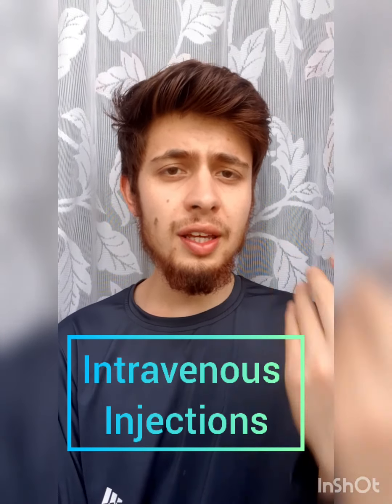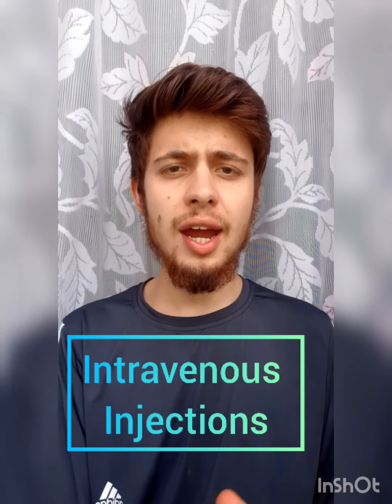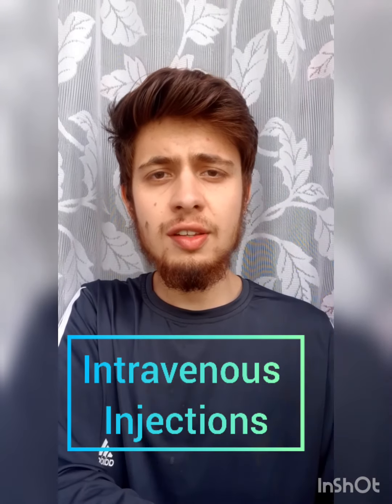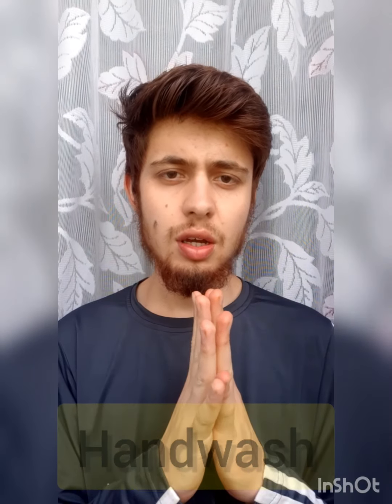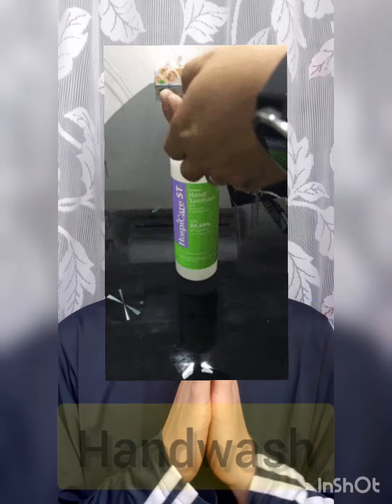Usually certain types of medications are given in this way. There are many sites; the most common site is the arm. We use the arm, and there are specific veins, like the basilic vein, where we can insert it. But before giving any type of medication, we should first sanitize our hands. We can also wear gloves, but it's better to clean our hands with the help of a sanitizer.